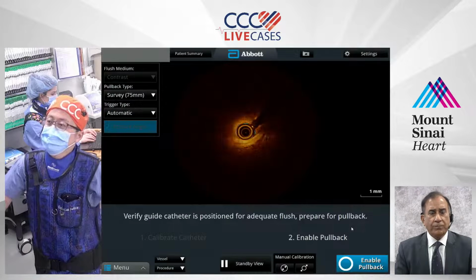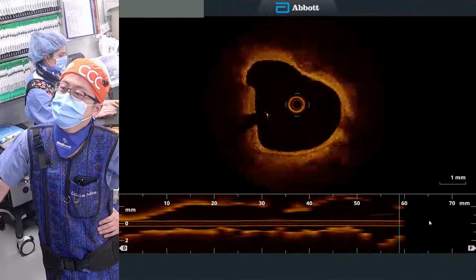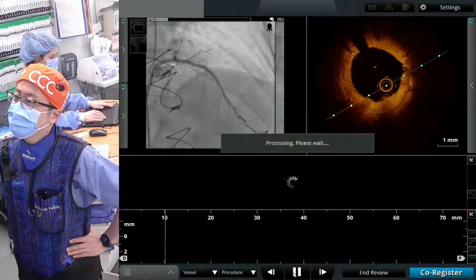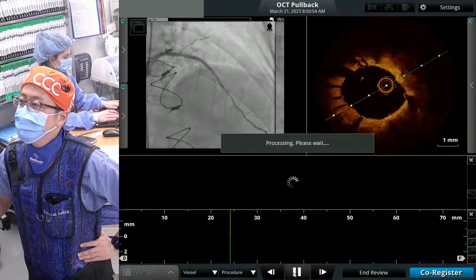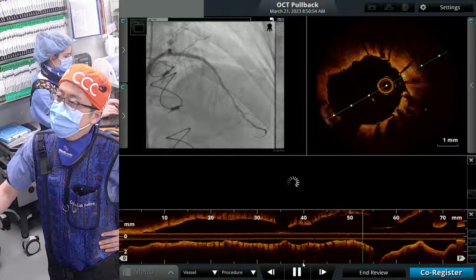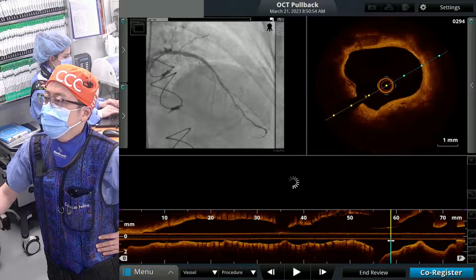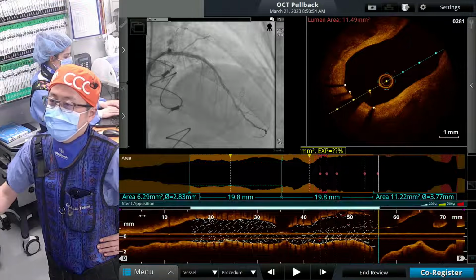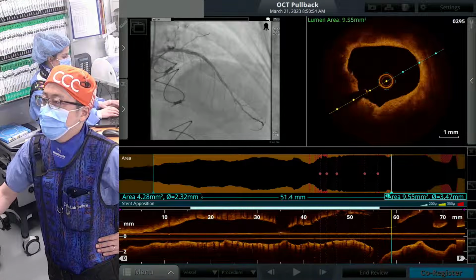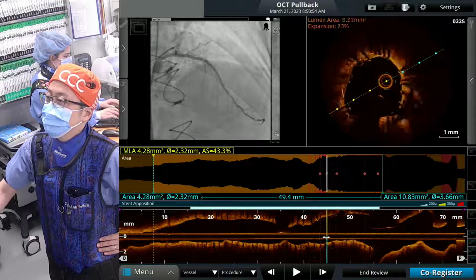Yeah, good clearance. It's ready. Yeah, beautiful. Checking the mid LAD. Okay, tell us now, Kiski, teach us what you see and what we should do more. One second. Yeah, the stent is expanded. I am checking the proximal edge also. Yeah, the stent just starts at the ostium, perfect stenting. In the bird's eye view, I don't see any red spots, which means the stent is on the horizontal frame. So this is the proximal. It looks perfect, normal position, well expanded. And at the level of the diagonal.